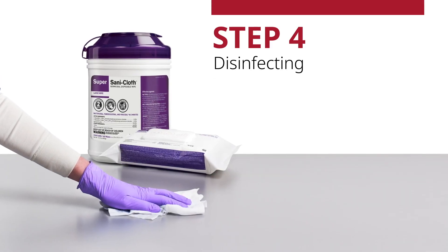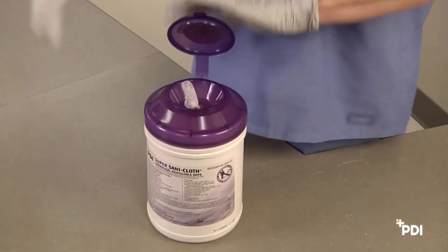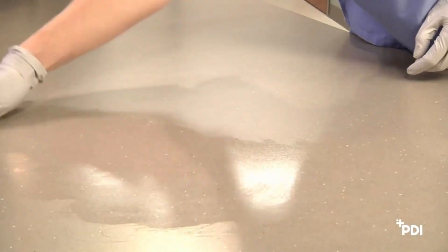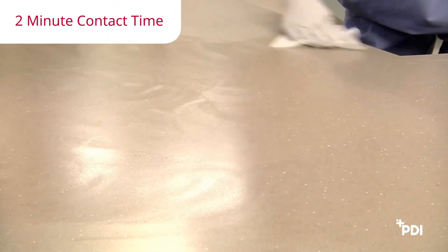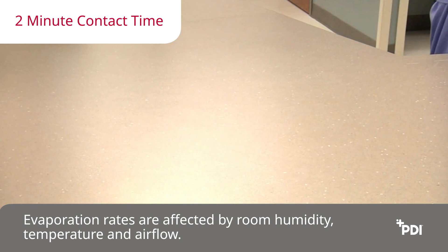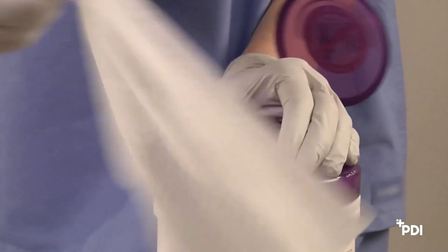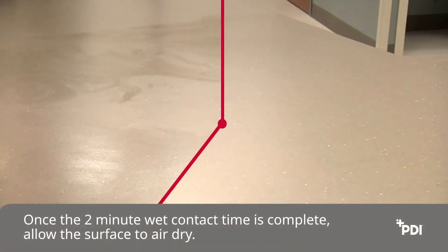Step 4: Disinfecting. To disinfect, there must be no visible soil on the surface. Dispense a wipe using the proper procedure in Step 2 and be sure to close the lid. Using the clean wipe, thoroughly wipe the surface, getting into crevices and corners. The highly absorbent material has improved fluid capacity and is both thick and strong. The surface must remain visibly wet for the full two minutes. Note that what looks wet on one surface may look different on another surface type. Evaporation rates are affected by room humidity, temperature, and air flow. These factors must be taken into consideration when following label directions. Use additional wipes if needed to ensure continuous two-minute wet contact time. Once the two-minute wet contact time is complete, allow the surface to air dry.